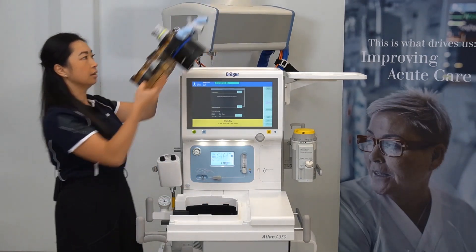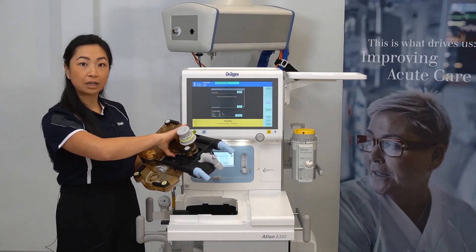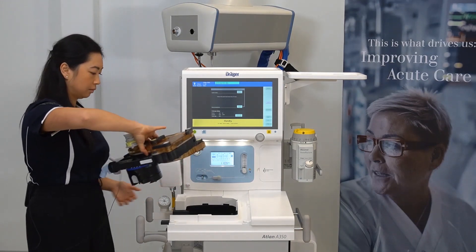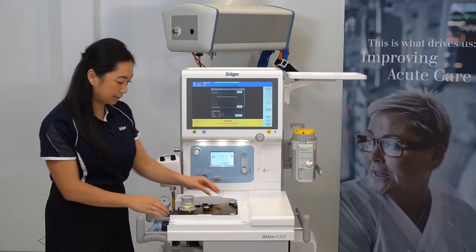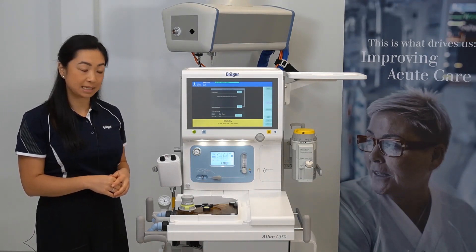Then, by placing your fingers on the finger grip of the breathing system, place the breathing block back into the device. Then use the green levers to lock it into position.